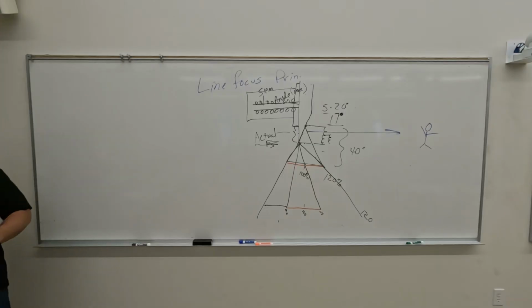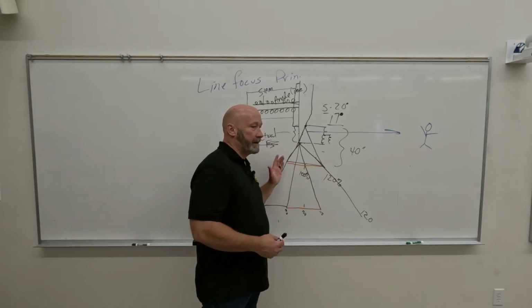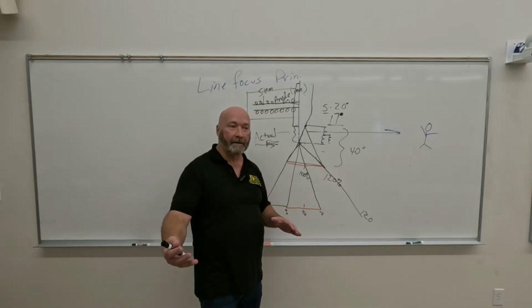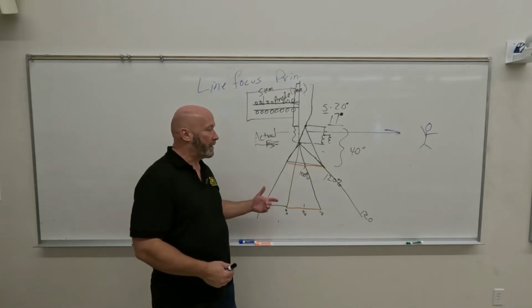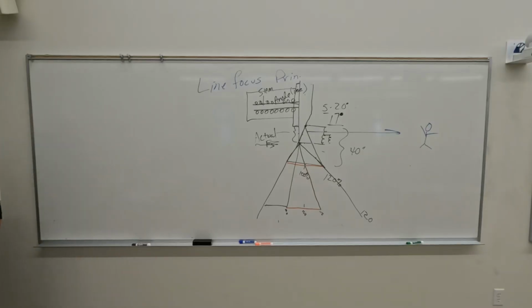So we tend to end the discussion on anode heel effect as the difference in intensity between the cathode and the anode end of the X-ray tube, and that's part of it. But the other parts are two things. One is that it gets better with increased SIDs. By better, it means that the cathode and anode end emissions are more similar. And also we get a decrease in sharpness or recorded detail on the cathode end as opposed to the anode end. So we're going to hit that again next semester, just planting seeds on those. But the intensity difference is really pretty much where we're landing right now.